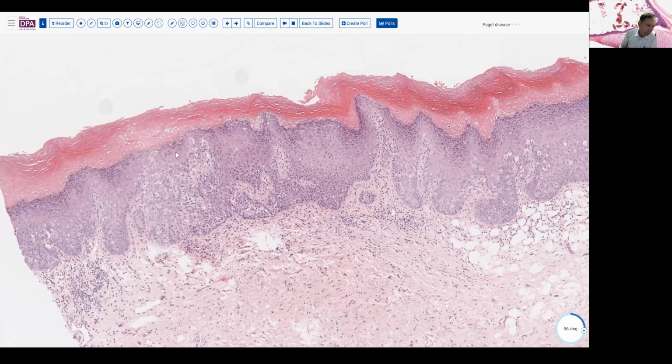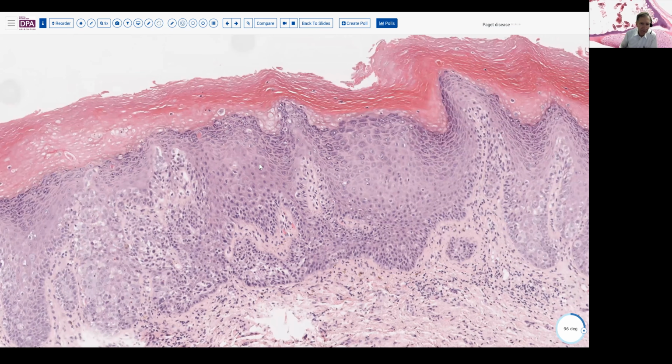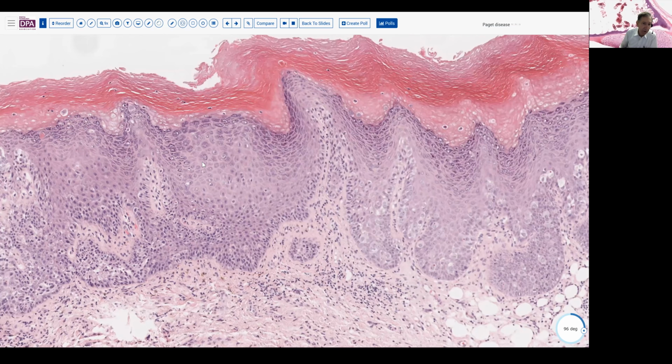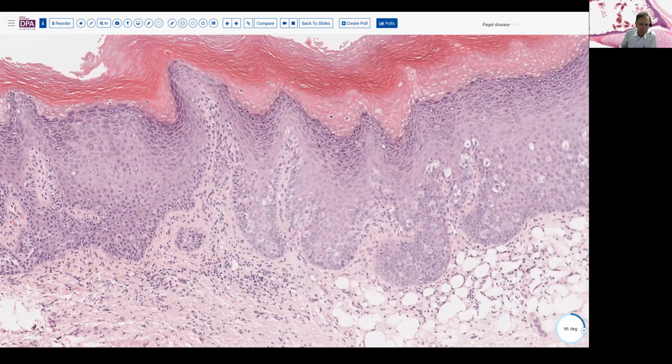Here we see some up in the granular layer, and here's one in the actual cornified or keratinized layer. So we can see that these cells, like melanoma cells, tend to have this upward migration that is very helpful in identifying them as malignant, because benign nevuses and so forth don't send their cells upwards into the epidermis and into the stratum corneum.